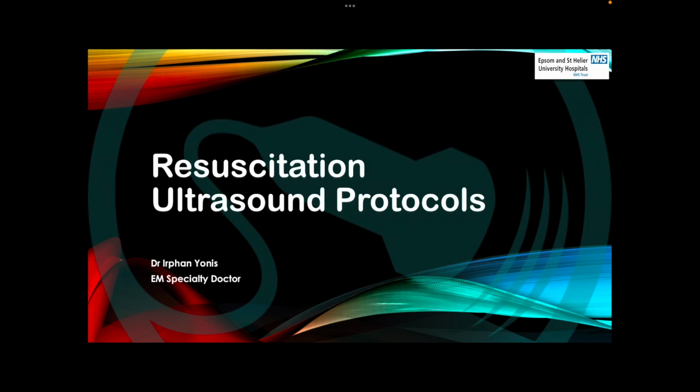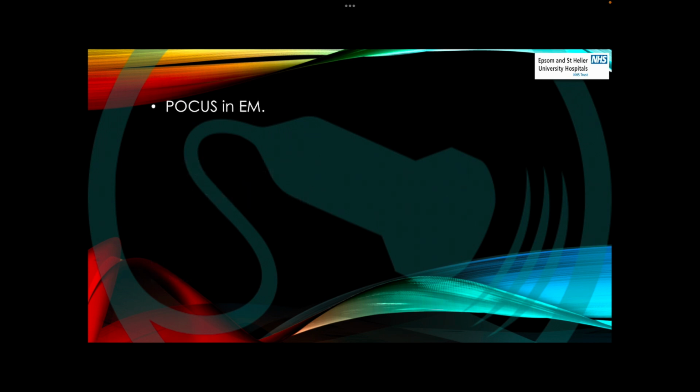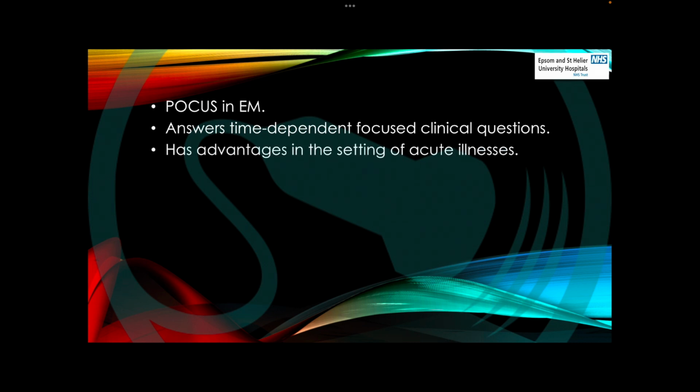So, before starting our presentation, let's talk about the introduction to the topic. The bedside focused or point of care ultrasound is becoming an established technique within emergency medicine and critical care to answer time-dependent, focused clinical questions. It has some advantages for the physician over the traditional imaging modalities, particularly in the setting of acute illness. It is safe, rapid, non-invasive, and comes to the patient's bedside.